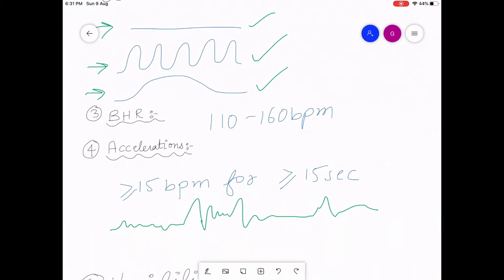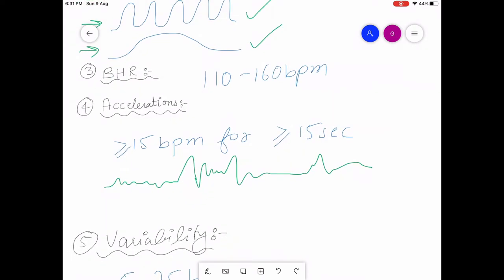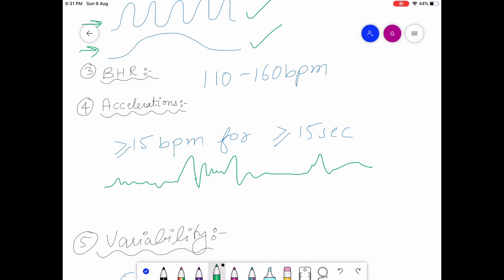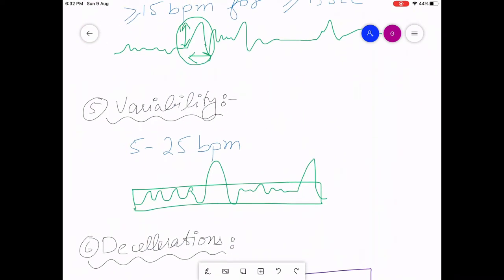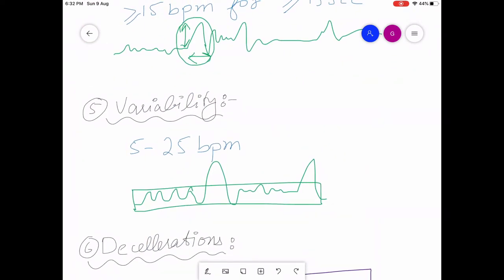Baseline heart rate is 110 to 160 beats per minute. Regarding acceleration — as discussed earlier, acceleration means the heart rate rises by greater than or equal to 15 beats per minute and persists for greater than or equal to 15 seconds. So if this is an acceleration, it should rise 15 beats per minute and persist for 15 seconds.